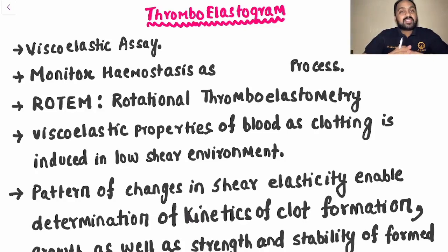Hi friends, in this video we shall be discussing a very small topic, which is your thromboelastogram. We shall be mainly focusing on the tracing of a thromboelastogram. But before we proceed, what is a thromboelastogram? It is a viscoelastic assay.